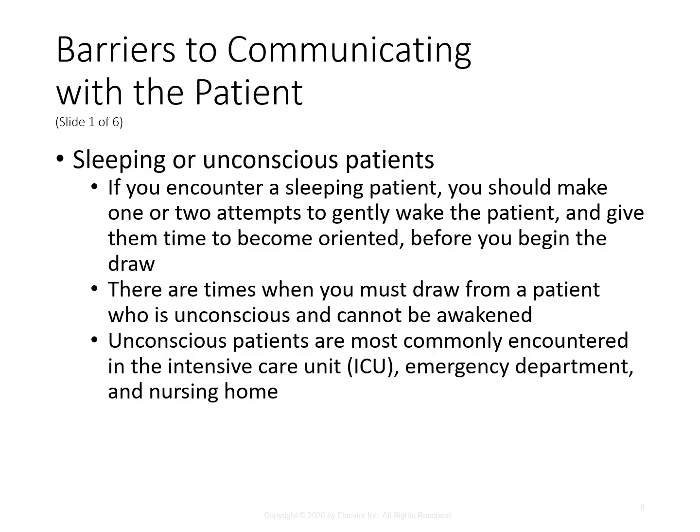Drawing from a patient without their consent, once again, may expose you to charges of assault. There are times when you must draw from a patient who is unconscious or cannot be awoken. You need to make sure that you treat an unconscious patient just as you would a conscious one, including identifying yourself and describing the procedure. These unconscious patients are usually found in the ICU, emergency department, and sometimes nursing homes as well.